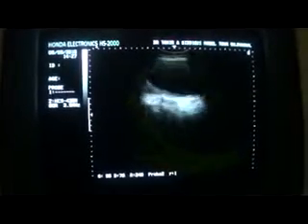So the uterus is normal, and the rest of the parameters are all normal. Thank you very much. This is our case of today.